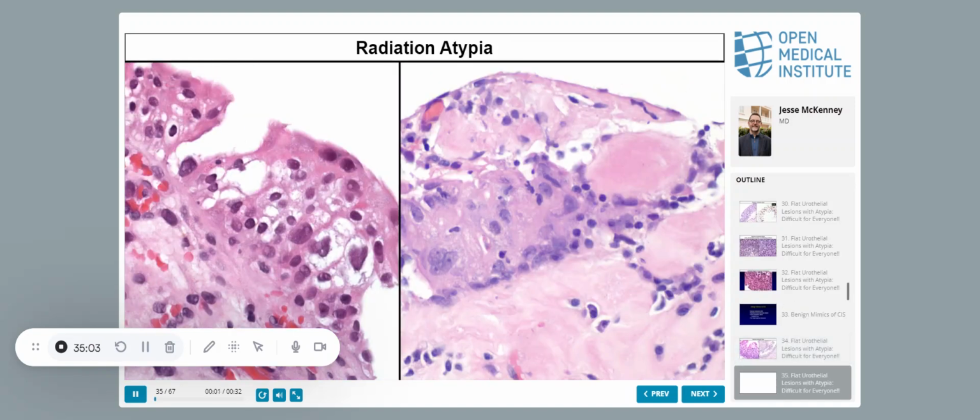Okay, this is radiation. Post-radiation, it makes all the cells look like umbrella cells. So you get more vacuolization, you get a lot of multilobation. You can get fibrin deposition and accumulation. Again, see how this is multilobated? If I ever see something like this, particularly with fibrin, you automatically go look and see if the patient has had radiation.